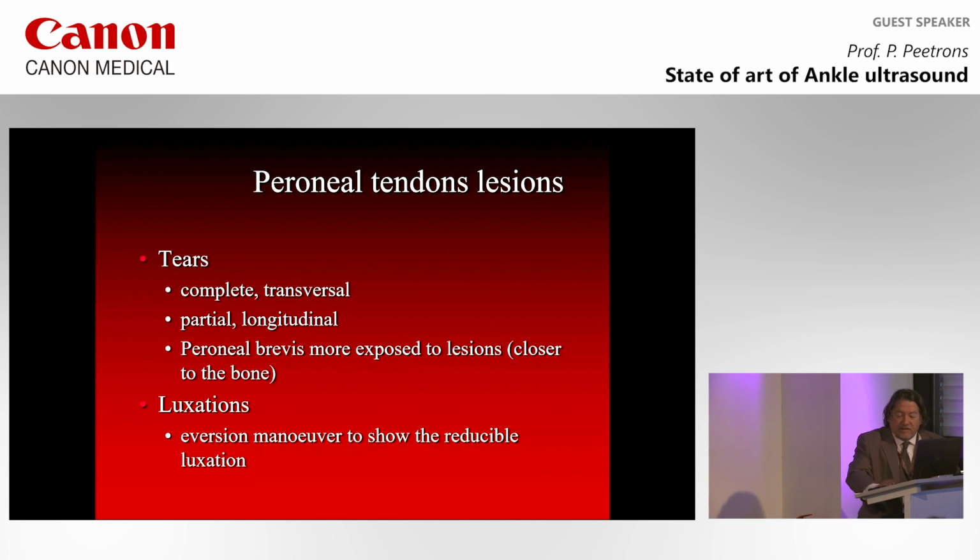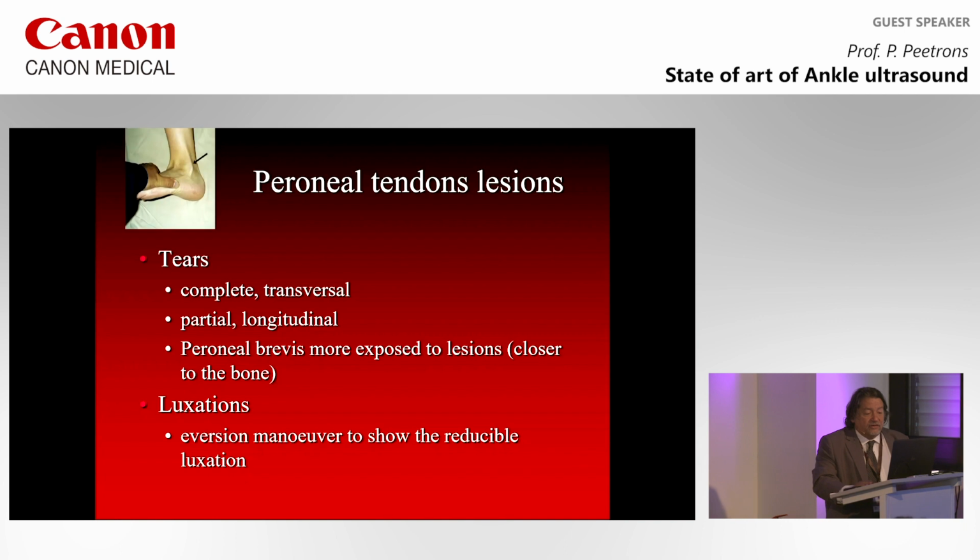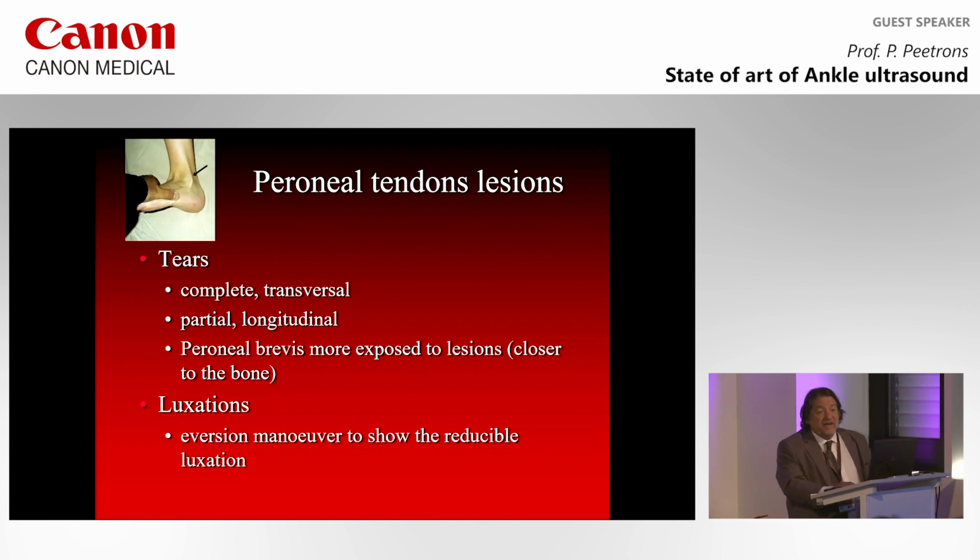So this is a superficial peroneal nerve. Don't forget to look at the tendons also. Don't forget to test the tendons, to test the tendons with an eversion maneuver.